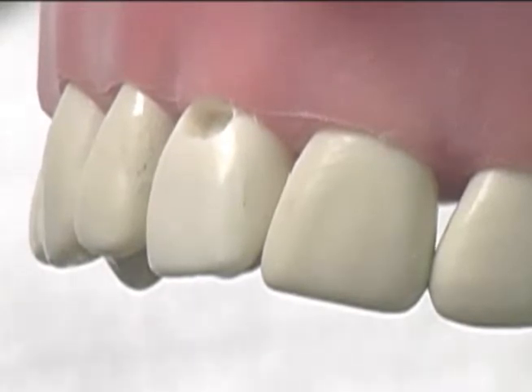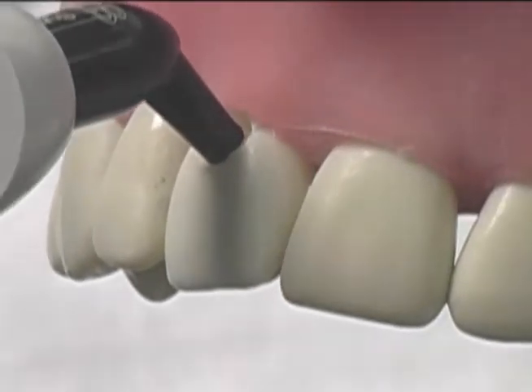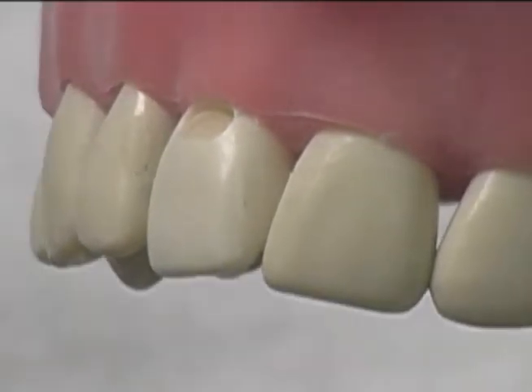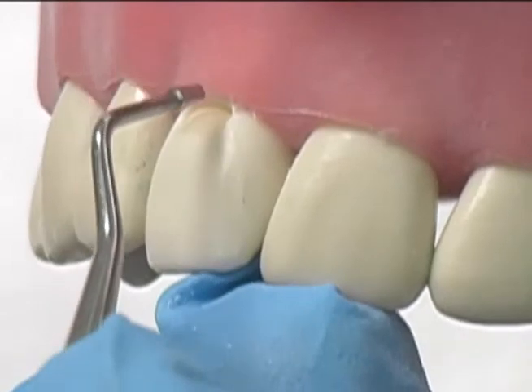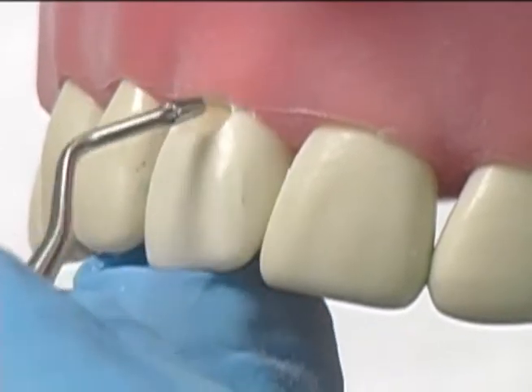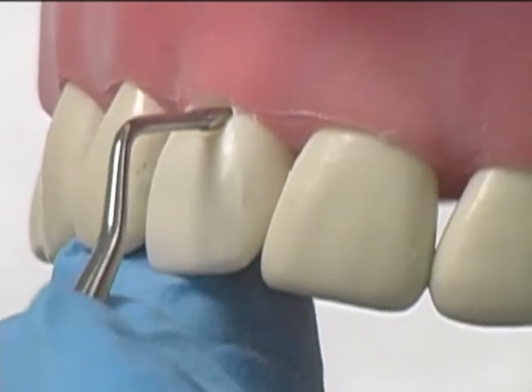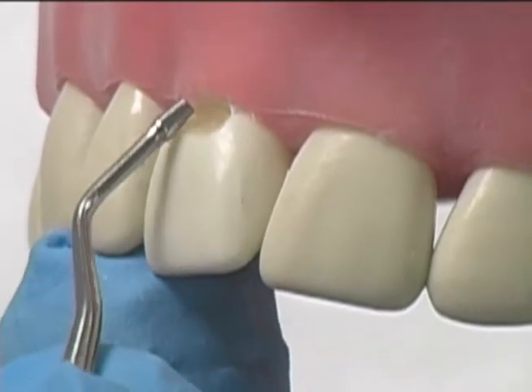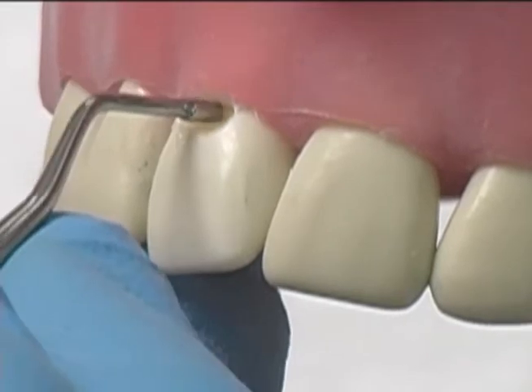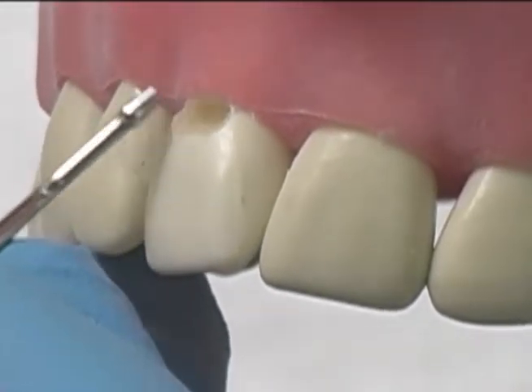We'll place the initial increments of composite, being careful not to overload and not to try to cure it all at once, which could result in contraction shrinkage. Condense it towards the axial wall, and I like to layer at an angle. My preference is to bond the first layer in attaching to the enamel and leave no composite touching the cervical, especially if the cervical is dentin only.